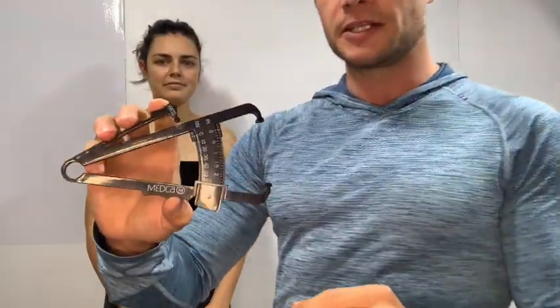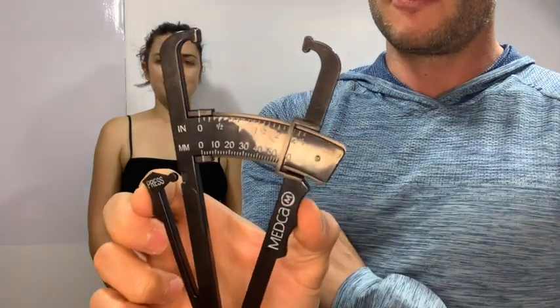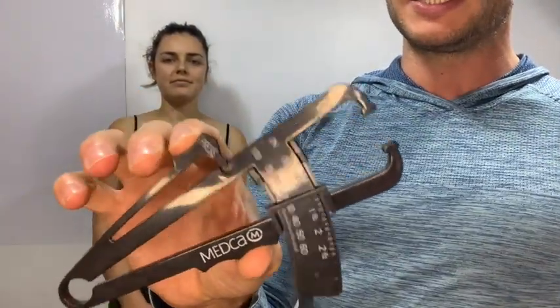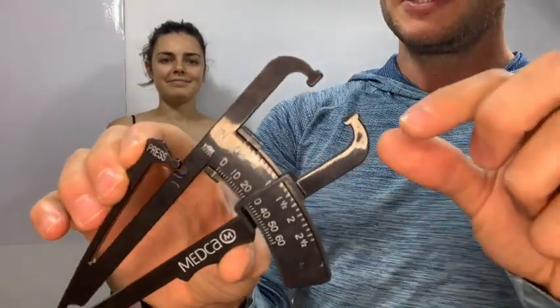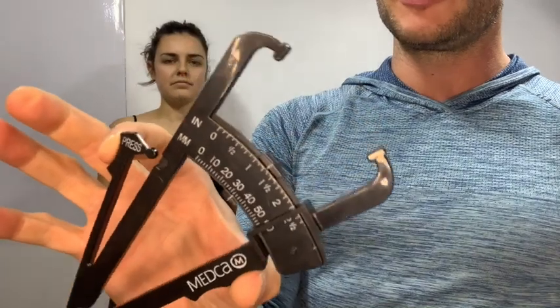Now, you already have some available to you, but this one's a little more specific to the type of calipers you have in your kin kits. Again, this one might be a little different than what you have, but just to show you a little closer up. When you're actually taking your measures, you're going to want to be sure that you're quite light on the calipers. And mine actually has this little slider scale, which is really useful.